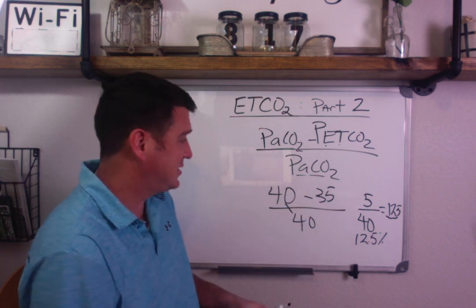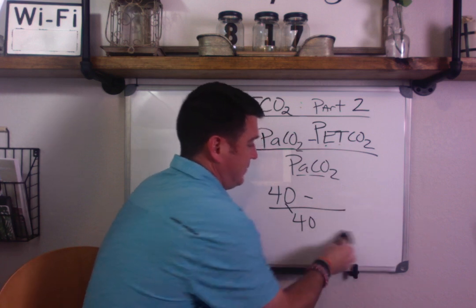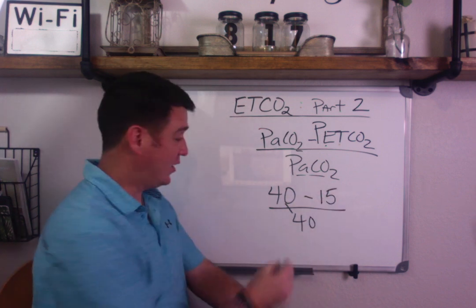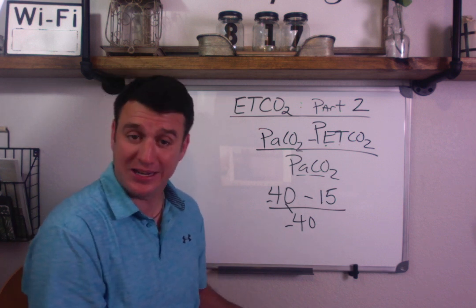But what happens when we have an end-tidal CO2 of 15 and an arterial CO2 of 40? We get something completely different here, right?